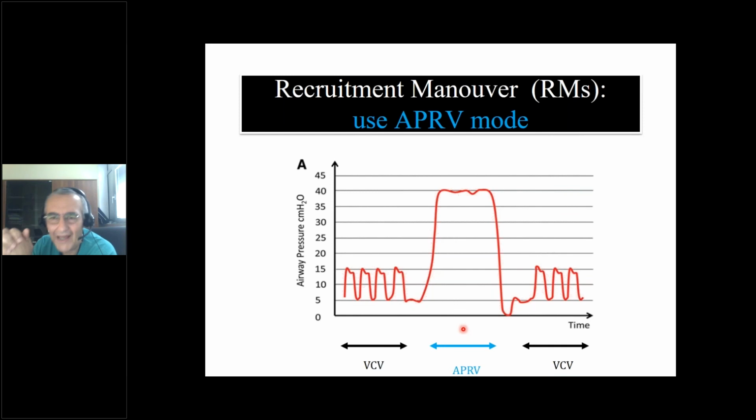That's very important. And it occurs in many patients, especially at the beginning of the disease. How can we perform a recruitment maneuver? There are many ways. I share with you the mode that I have used for many years. I use the sustained inflation technique, only one maneuver for a long period of time. When I say long, I mean 20 seconds. And how can I do it?